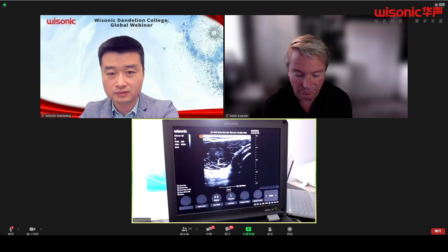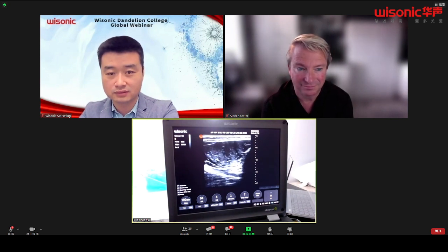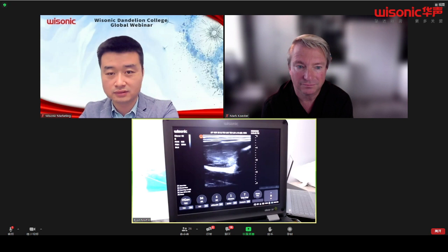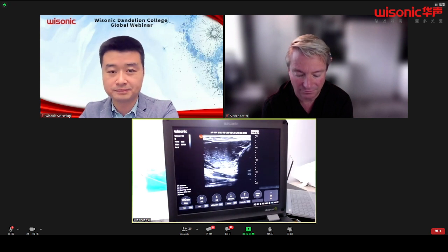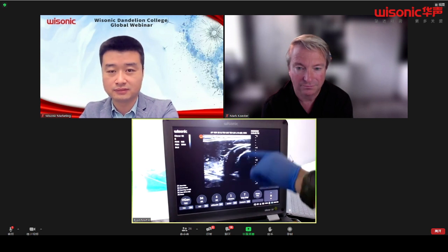This is your scan. This is your view right in here, following this proximal up until it turns to a muscle. So here's the muscle. It comes down, turns into a tendon right there. And it looks a little bright on my screen here. Hopefully it's not too bright on yours. Right to the radius. Again, right to that radial head.